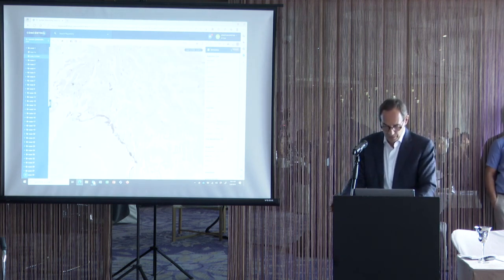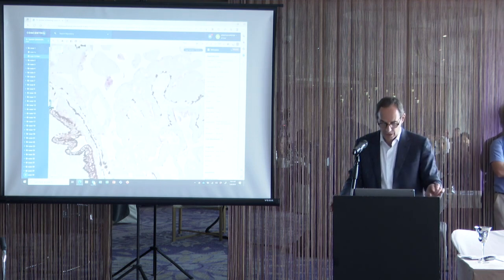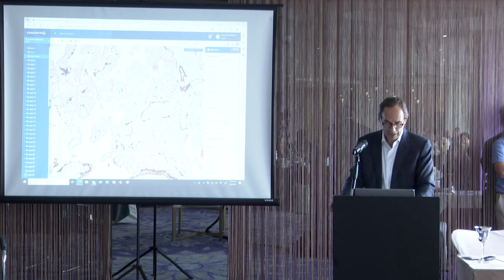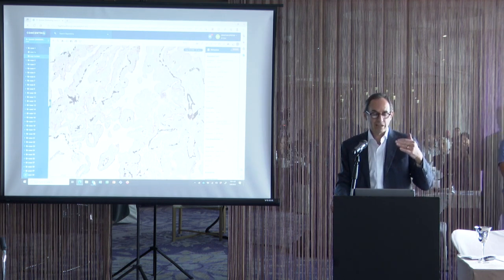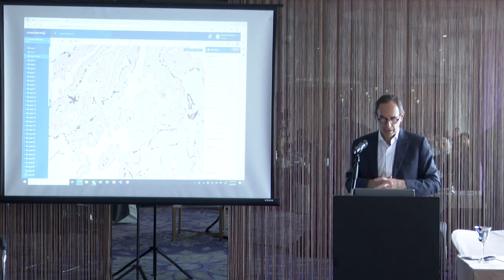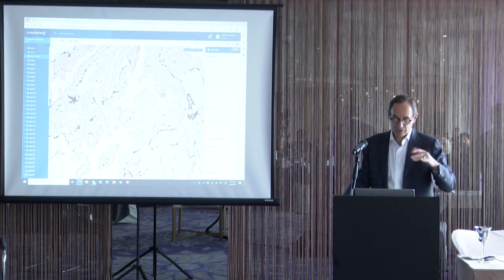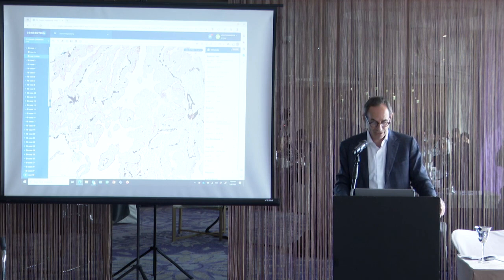And when you do the basal cell markers in this case, you can see that basically all of these papillary structures are still above the basal layer and are surrounded by a basal cell layer. So this is a rare case of prostatic ductal adenocarcinoma that's intraductal. It's non-invasive. In a sense, intraductal ductal prostate adenocarcinoma. So again, confusing terminology. Intraductal means location. Ductal adenocarcinoma is the type of prostate cancer, the cytology.